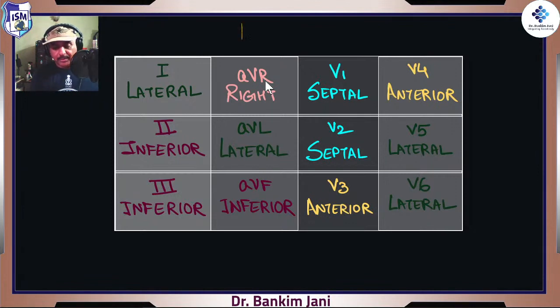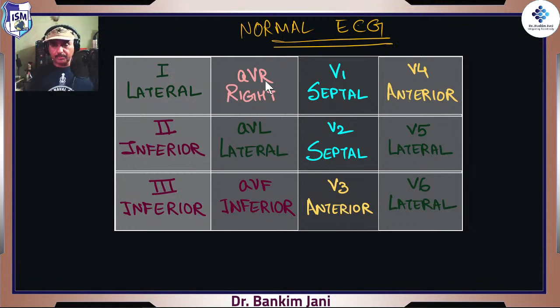This is how a normal ECG would be printed and given to you. That, yes doctor, just see, this is my ECG, how it will look.